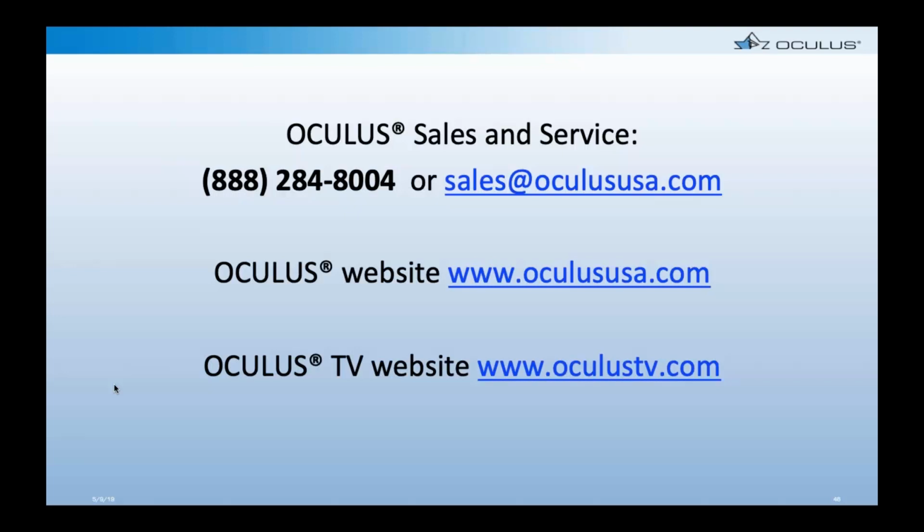One of them is a specific design, another one is a standard 4-curve, and then another one is a software integrated design. If you want to practice full scope ortho-K, you want to have a 5-curve, 4-curve, or 3-curve, 4-curve, and a software integrated design at your disposal, so you can cover the gamut.